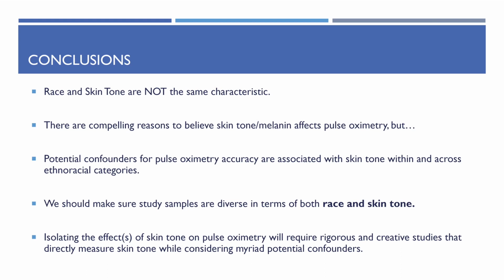So to go back to Dr. Hendrickson's excellent presentation, we may be dealing with something that is overdetermined by multiple different pathways simultaneously, and that means to isolate the effects of skin tone on pulse oximetry, we're going to need rigorous and creative studies that directly measure skin tone, which I'll talk about a lot more tomorrow, but also consider these myriad potential confounders.